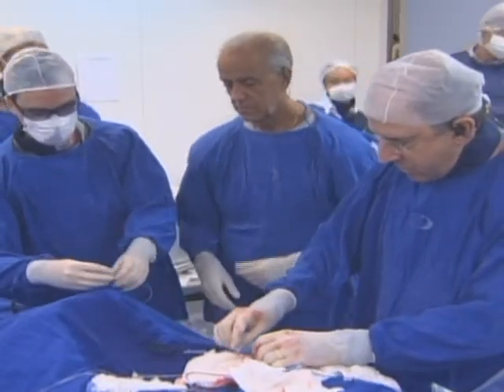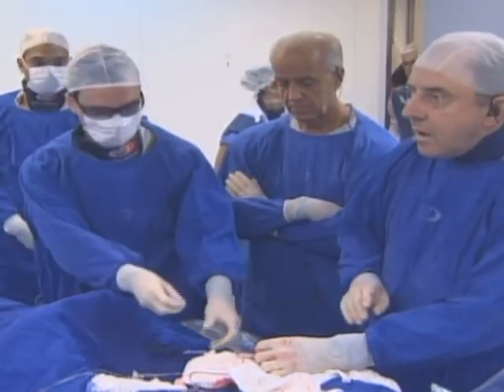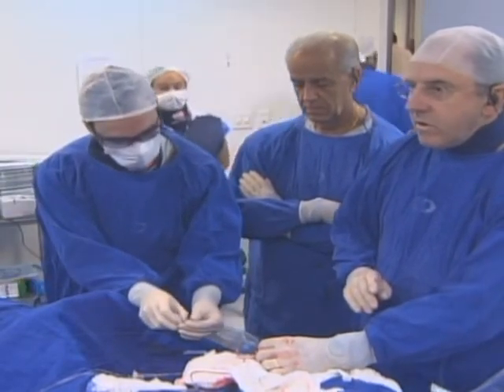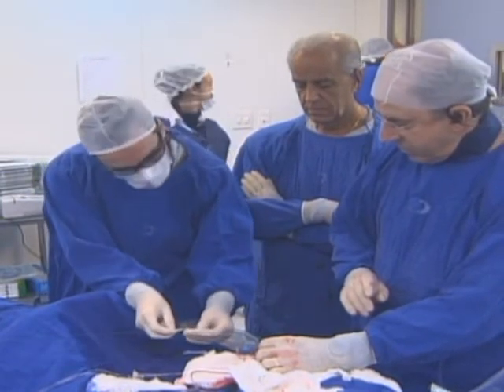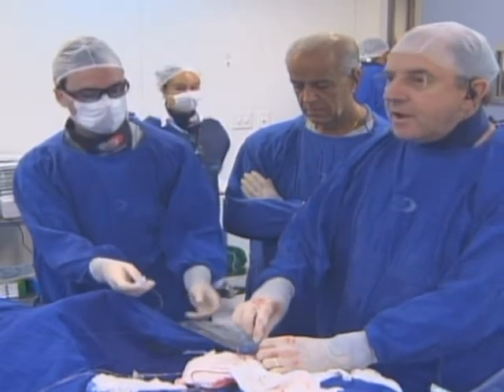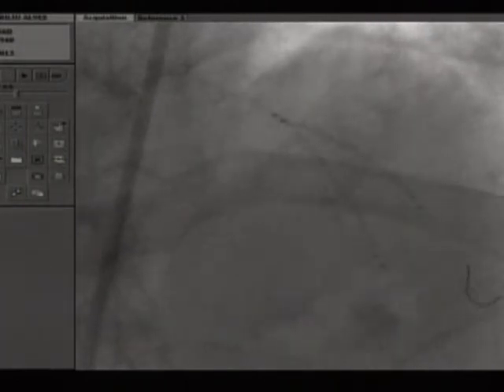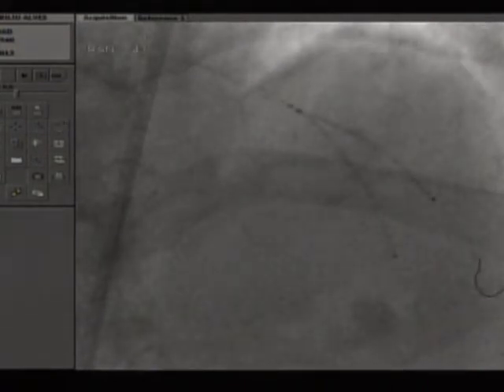I'm starting to feel a little discomfort with these two stents. I can hear Miguel saying that he is a little bit nervous here because the two stents are there for a long time, if the patient is experiencing any ischemia. Yeah, but it's a good comment. We control completely the ACT. It's good. We are working very quietly, and the patients are doing very well. No pain. And we have the support of Pedro Horta here.